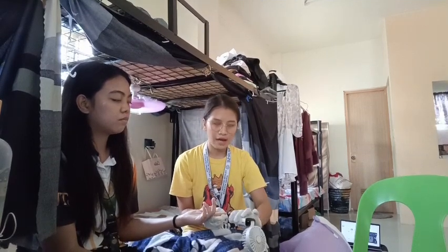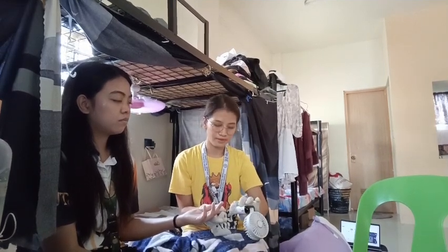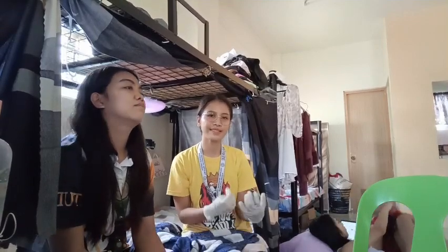Smearing blood on the strip may result in an inaccurate test result. So, press the button if directed by the manufacturer. And also, correct timing ensures accurate results. And also, pag nangyari na po siya, apply pressure to the puncture site with a cotton ball or dry gauze. And do not, wag na siyang iwawipe ng alcohol. Pressure causes hemostasis, while alcohol stings and may prolong bleeding.